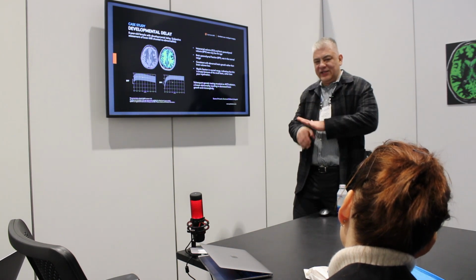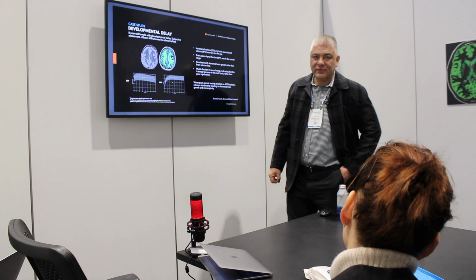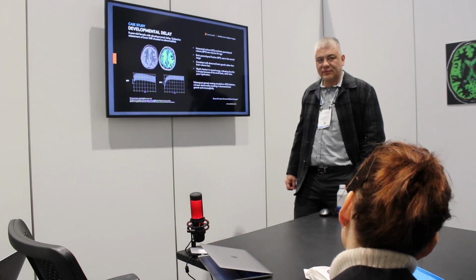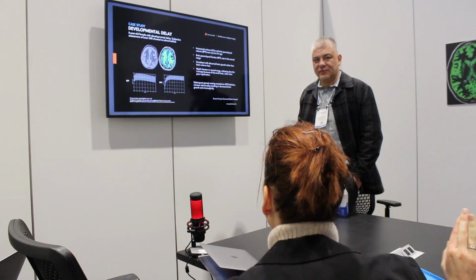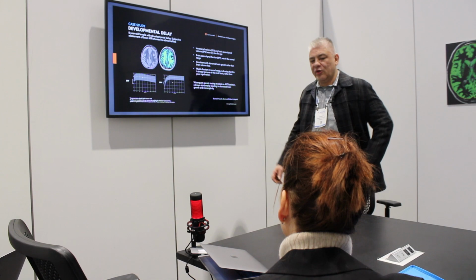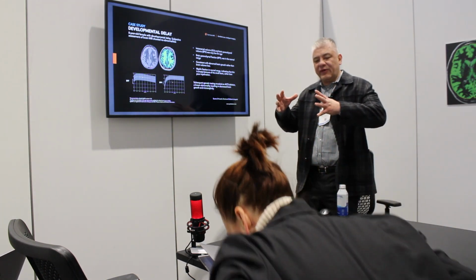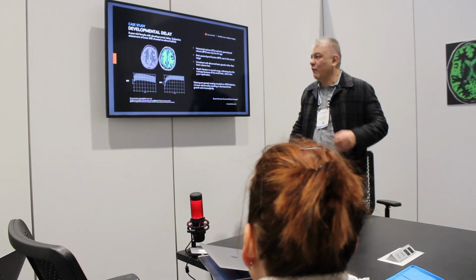like brain and CSF. And what they were able to determine by looking at the lower than normal brain parenchyma volume is that this was consistent with brain growth rather than being consistent with atrophy or something else going on. So it was a global brain growth problem rather than just a decreased myelin or a volume loss.